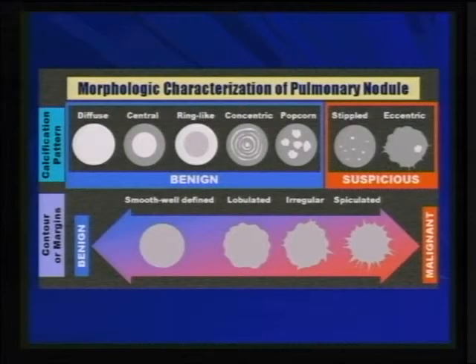We can look at the content of the nodule, of course, their characterization as far as if there is calcium and what type of calcium and distribution of calcium. I'm going to talk a little more about that later, but again, calcium usually means benign disease, but there's certain areas where calcium can also mean malignancy, and so not all calcific lesions are benign in nature.